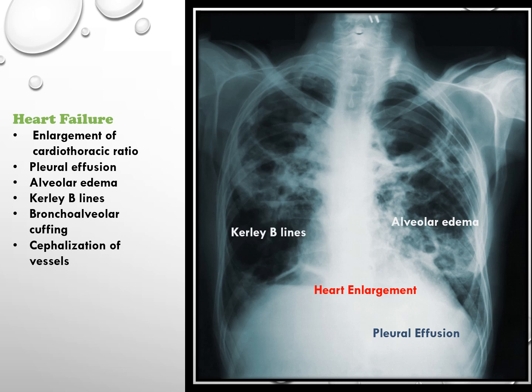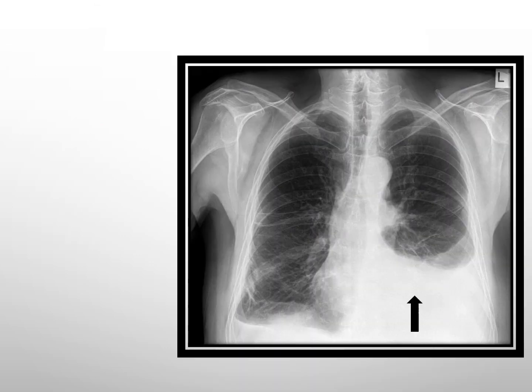Peribronchial cuffing suggests an accumulation of fluid in the small airways. Cephalization of vessels demonstrates a redistribution of blood in the vessels, often seen in heart failure.